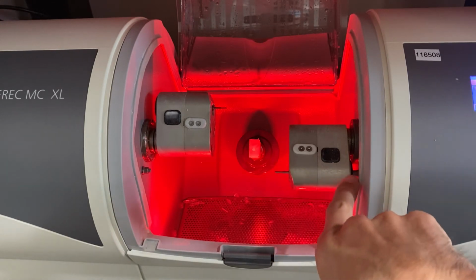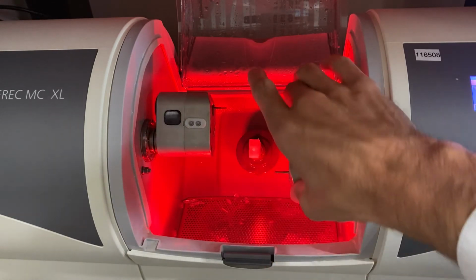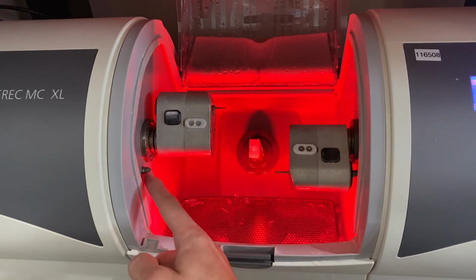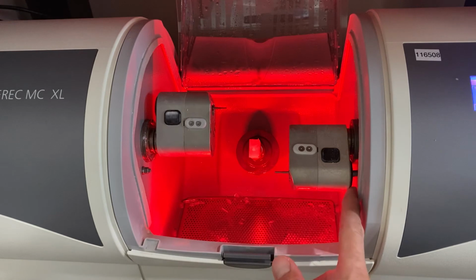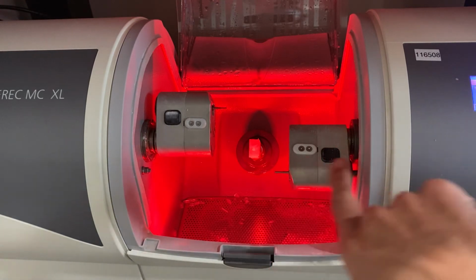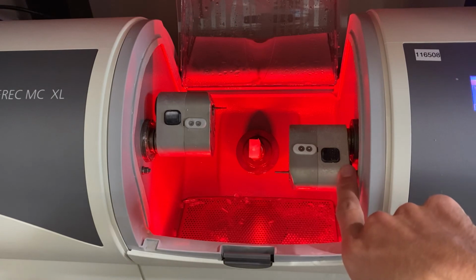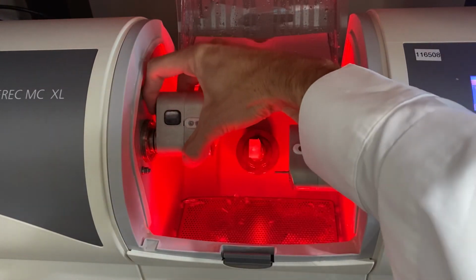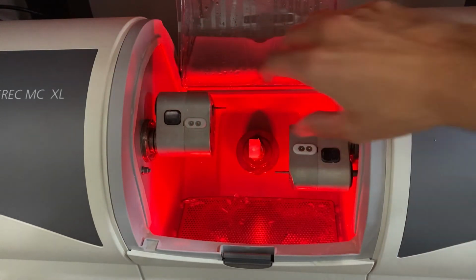Now, here on the back side, the step motor is pulled against the little metal piece. It's very similar to this, just on the other side, or exactly the same. It's holding a button on the back of the step motor. So if you're ever in a situation where you need to change a burr, but it's not in this position, you can reach around in here and hold the button in while you change it.